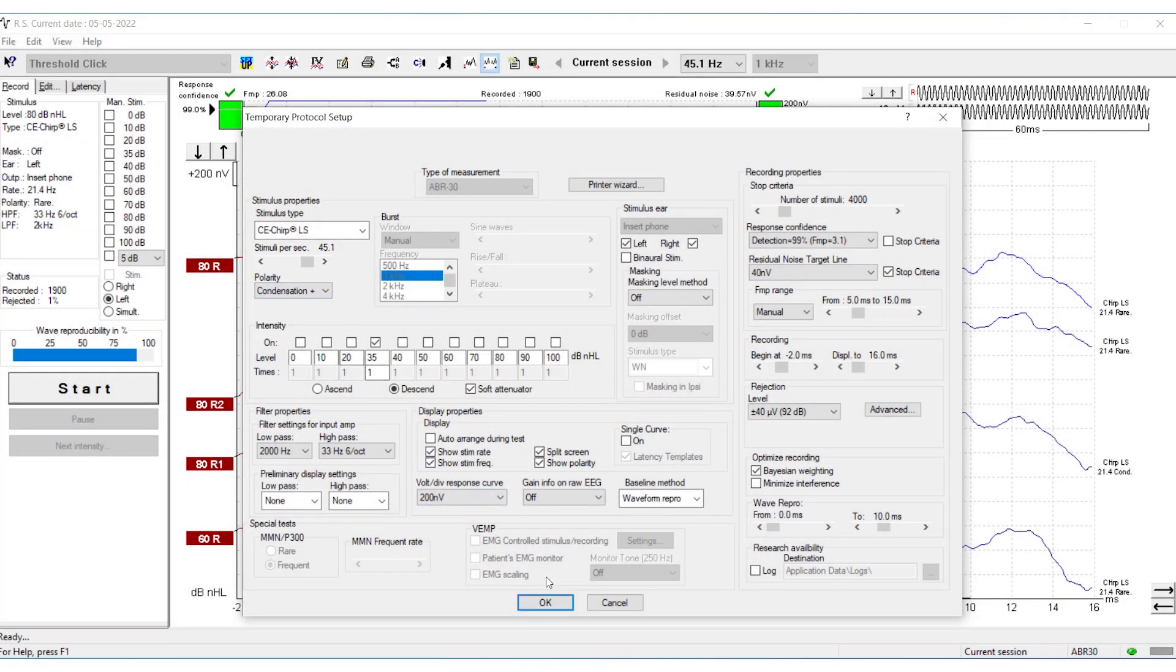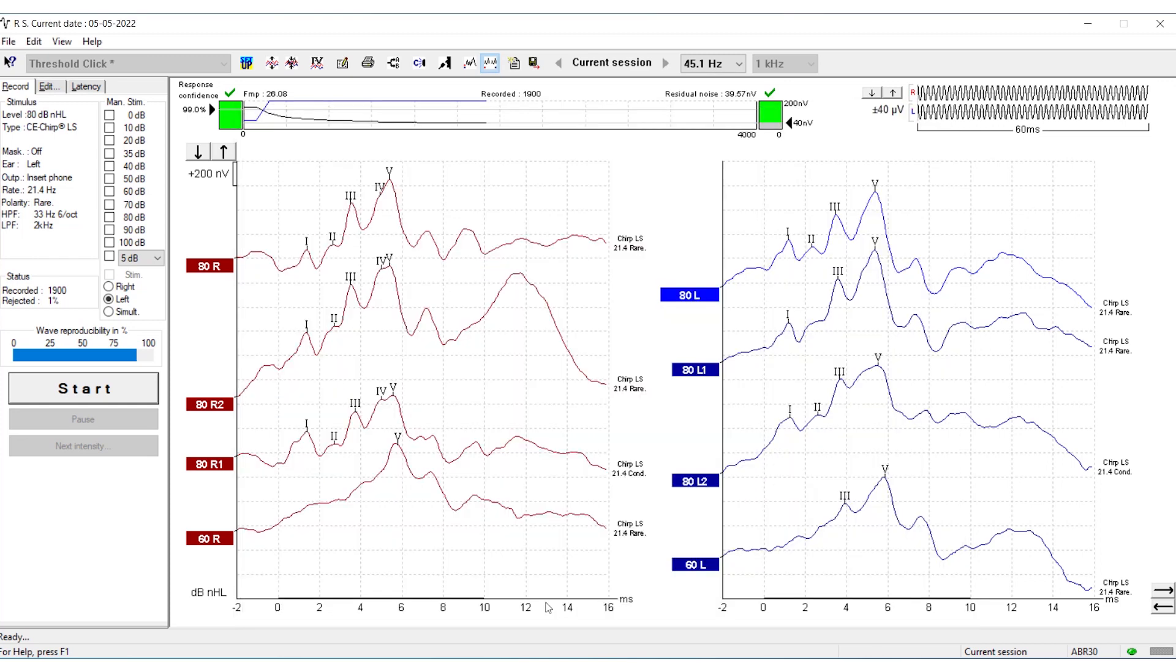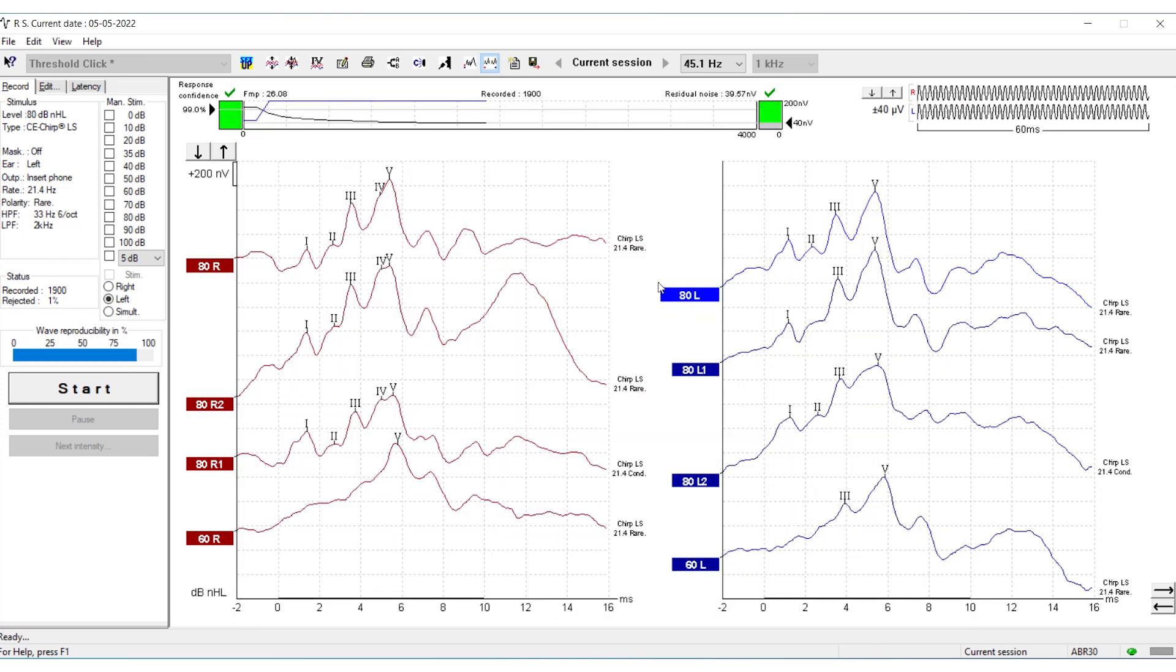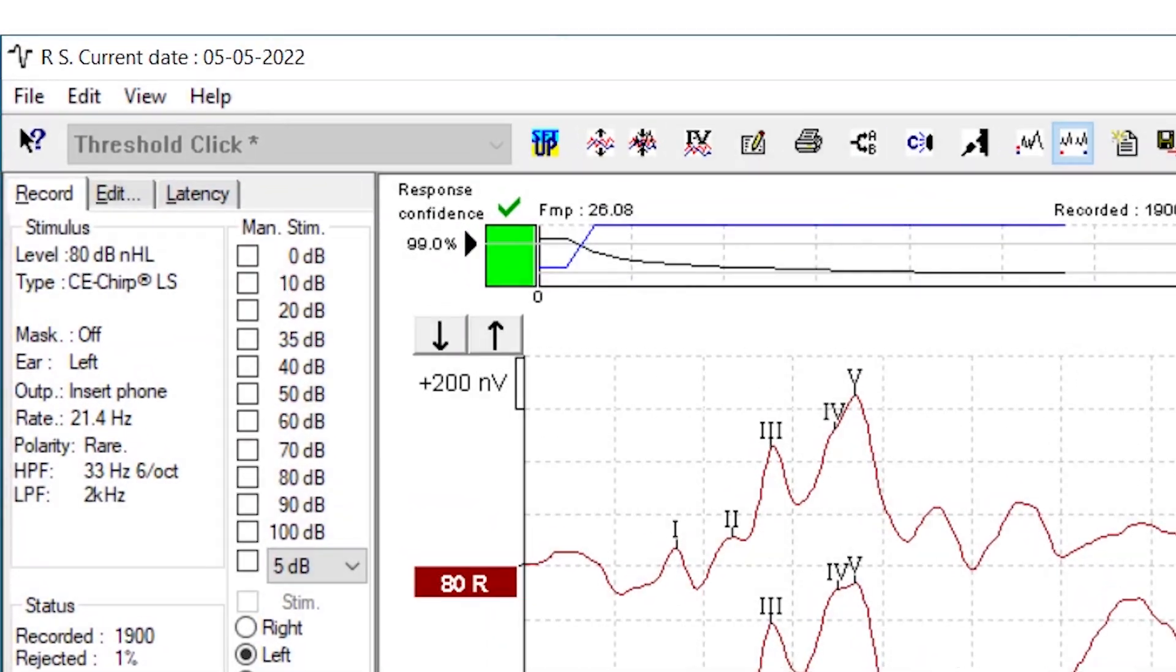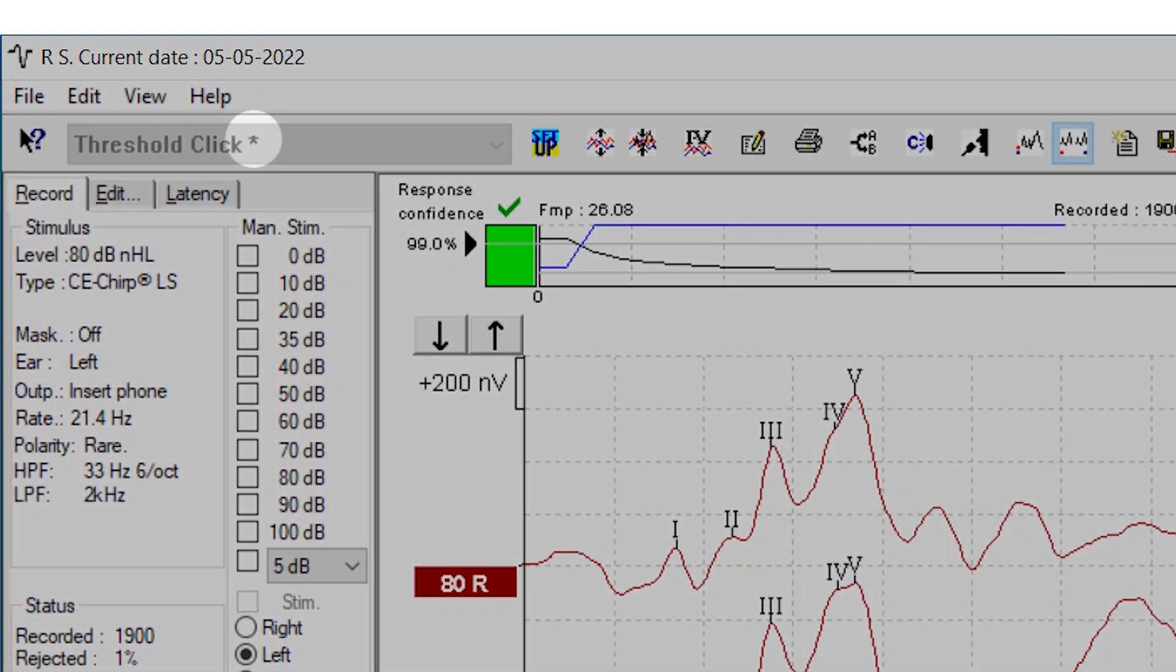Then press OK. You have now changed the stimulus type to condensation for this measurement only. A temporary change is marked by a star.